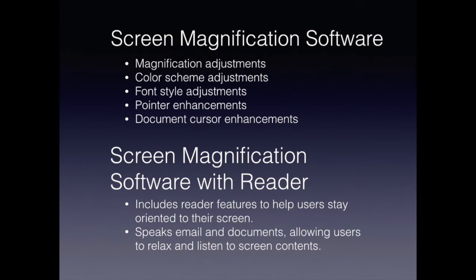What are the commonly used purchased screen magnifiers? There are several types. One is a screen magnifier, a simple screen magnifier. It does magnification. It allows you to change color schemes, changes font styles, enhances the mouse pointer and the document cursor for better visual use of the computer. It is used solely for visual uses.